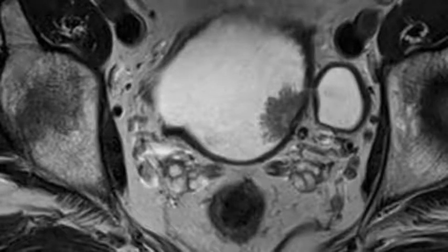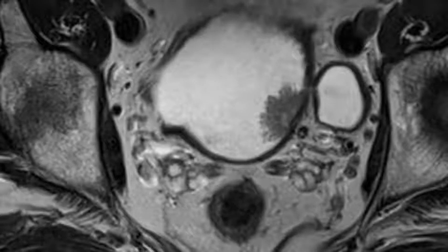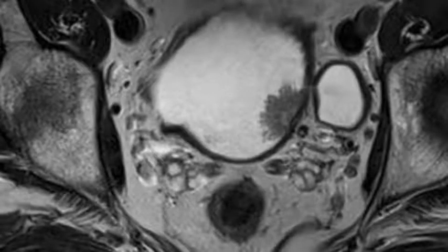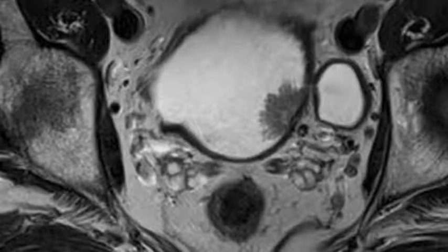Whole body CT is the primary imaging technique for detecting metastases in affected patients, especially those with muscle-invasive disease. The role of newer MR imaging sequences in the diagnosis and local staging of bladder cancer continues to evolve. Advances in MR imaging technology have made multiparametric MR imaging feasible for the local staging of bladder cancer to optimize treatment.